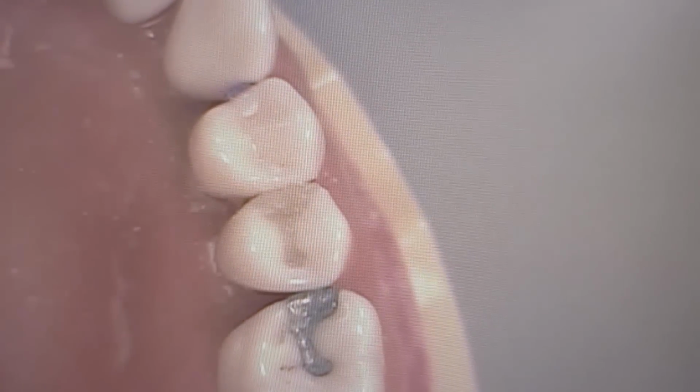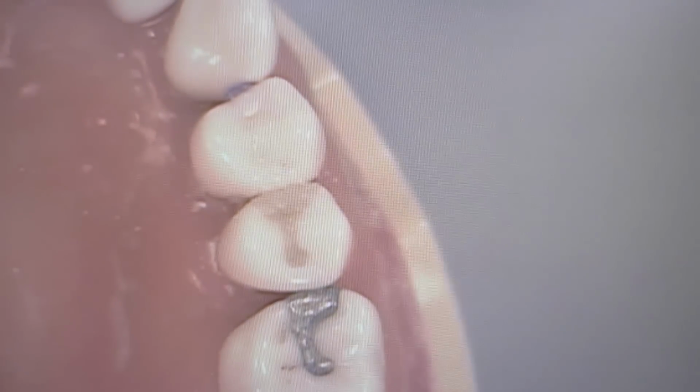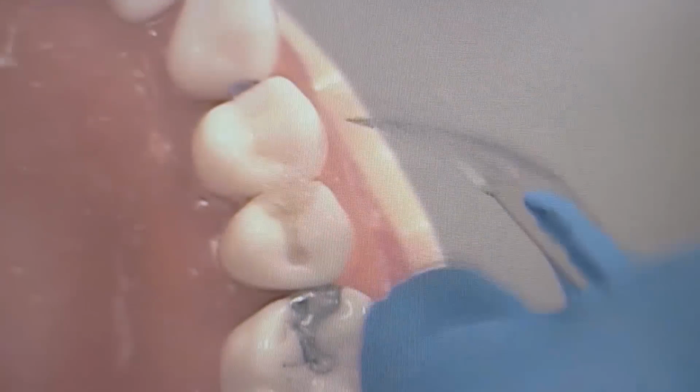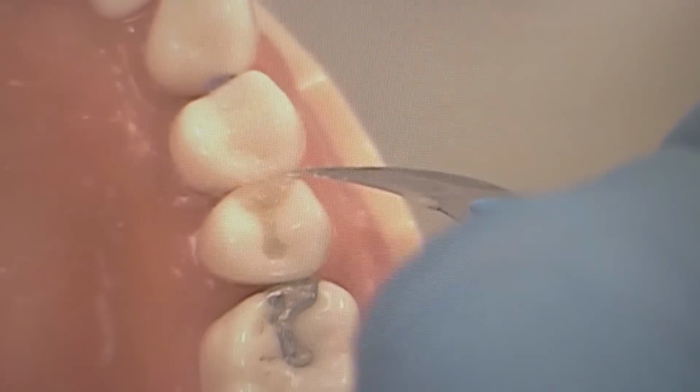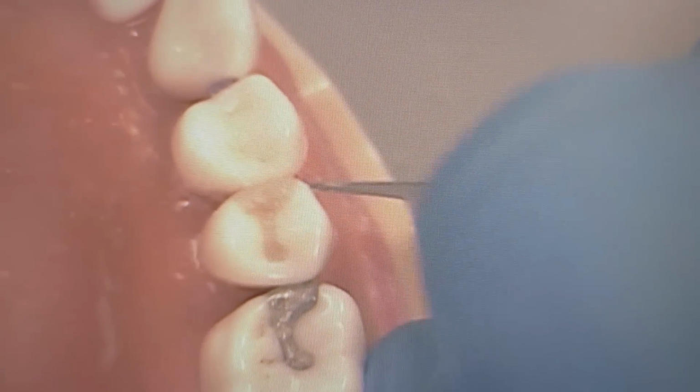So what do you think of the contour? Slightly over contoured. Probably a little bit bulbous on this palatal, right? How would you fix it? You would use the 12 blade to correct that, right on the side right here. Using the 12 blade to correct the over contour. 12 blade, yeah. Use that, but don't get too crazy with it.